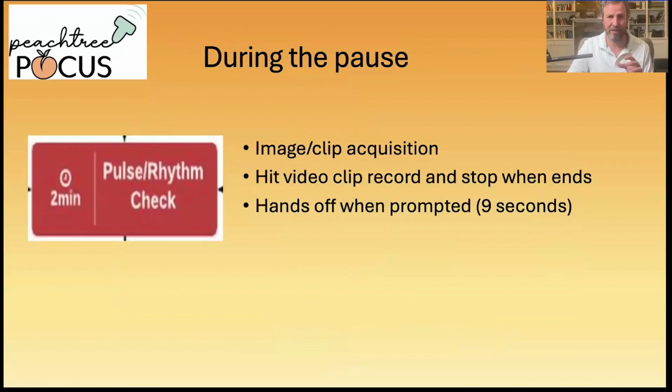Firstly, just get the clip, especially if you're early in your ultrasound journey and it can take you some time to get the view. Don't waste the pause trying to capture the perfect image and interpret it at the same time in real time. Hit record, save a short clip, and then review it during the compressions. That keeps your pauses short.